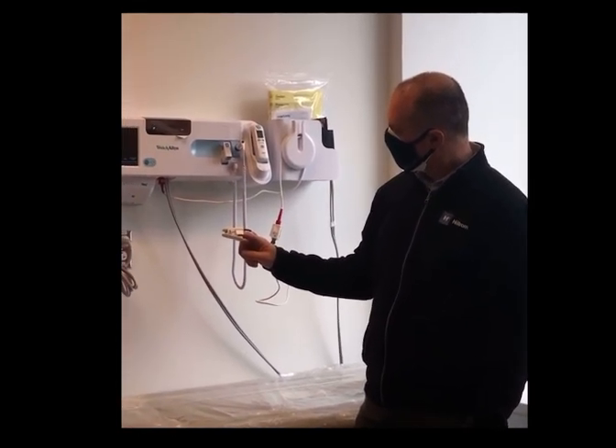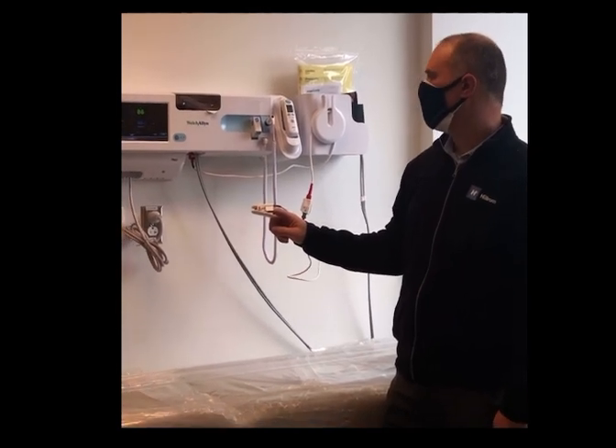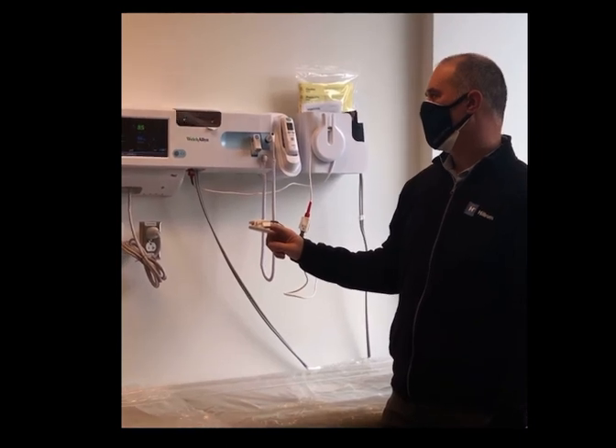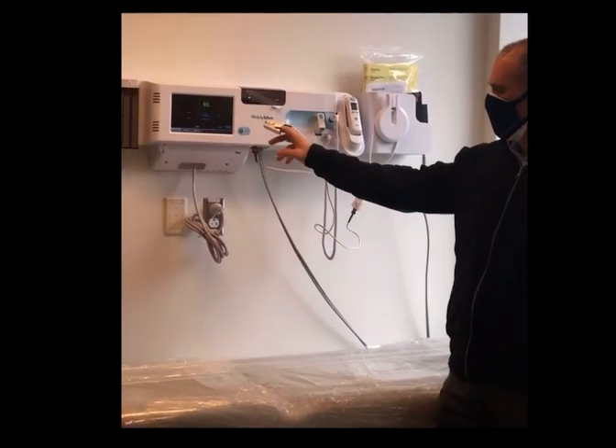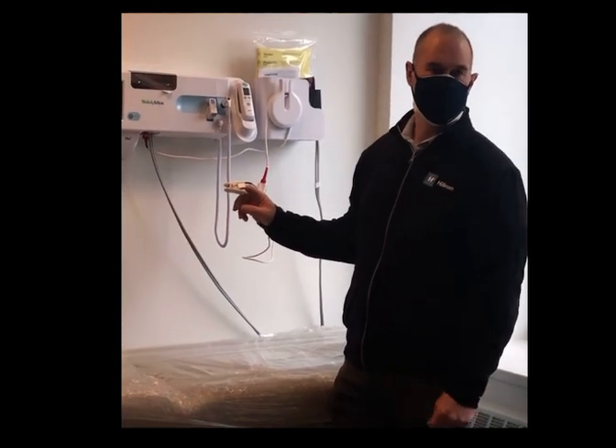It will give you a reading — about 99. It's a live reading, so you can see the pulse rate will change. And it's also giving you the perfusion index, which is how good the signal is between the skin.